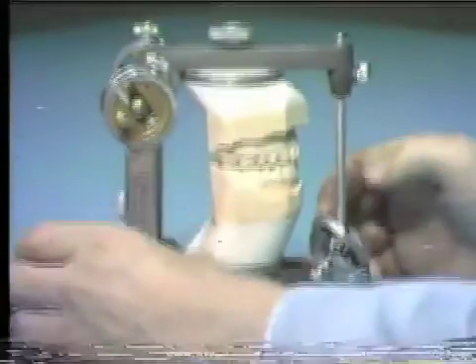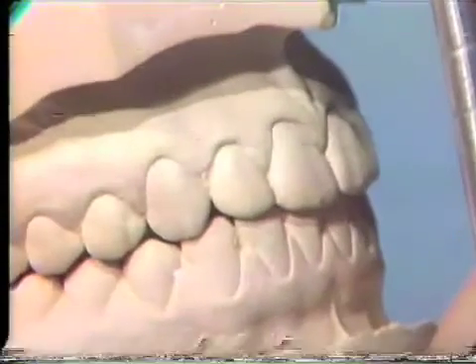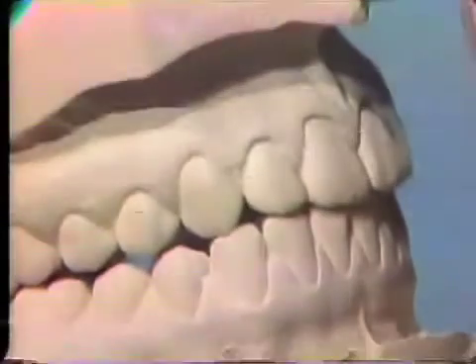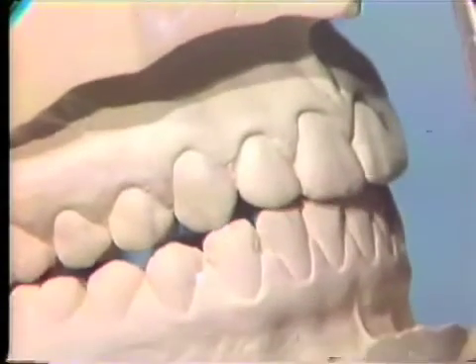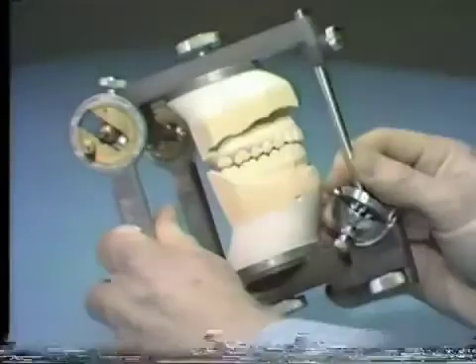Guidance on the working side during lateral excursions and on the anterior teeth in protrusion results in smooth mandibular movements and does not necessitate complicated neuromuscular responses to avoid posterior interferences. The guidance switches between the left and right incisors during the protrusive movement. Since the contact is not even on all the incisors, the protrusive movement is not smooth. This can be partially corrected when the maxillary right central incisor is waxed into occlusion. Guidance should be waxed on the maxillary right central incisor in harmony with the guidance on the left central incisor. The posterior supporting cusps disclude as soon as the protrusive movement begins.